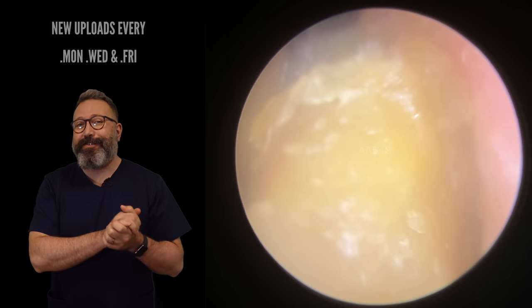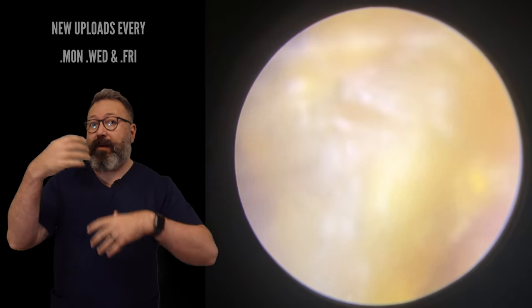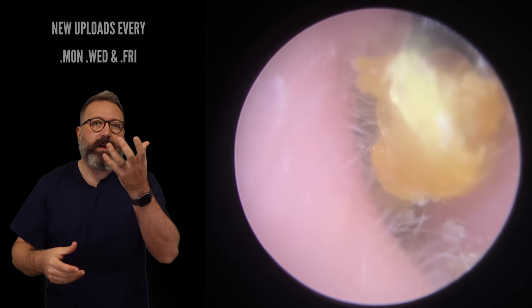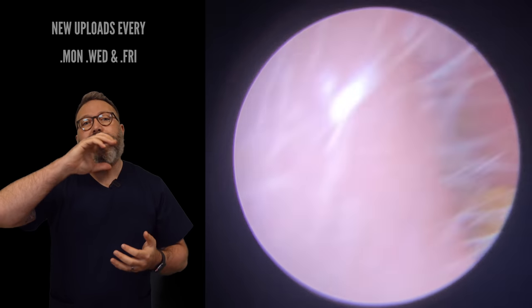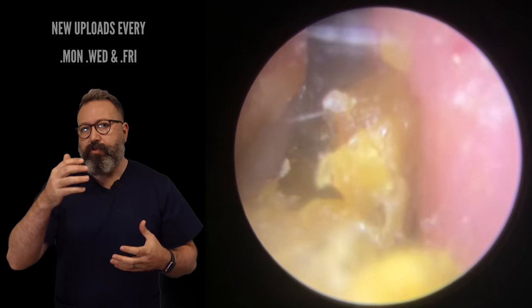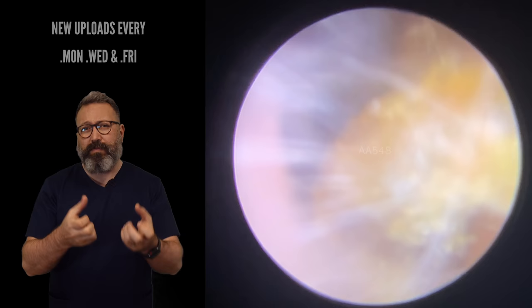So we're going to come in here with the Jobson horn. You can see how humid this gets very quickly. Don't forget, when we're suctioning, we're drawing all the moisture out. But when you're using a tool like this — what they call curettage, the Jobson horn in this case — you've got nothing taking that moisture away. So sometimes you'll get this very humid ear canal and everything starts to mist up. But this wax is tough as old boots.